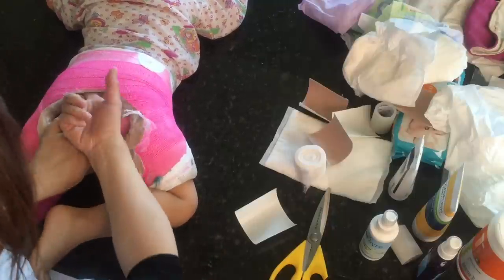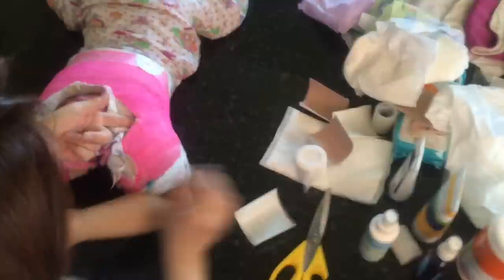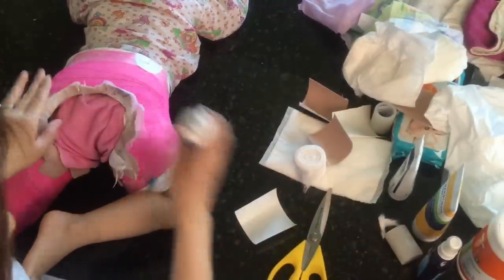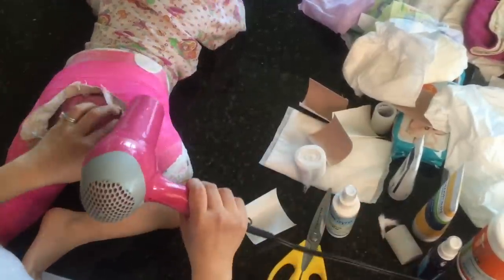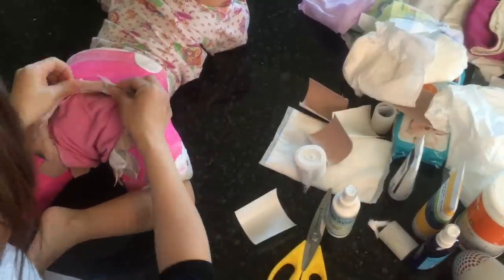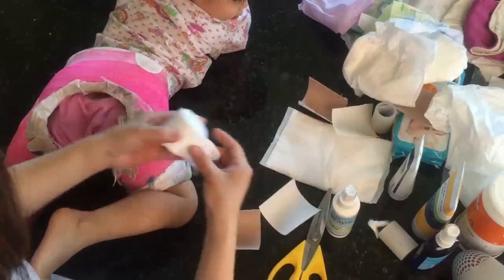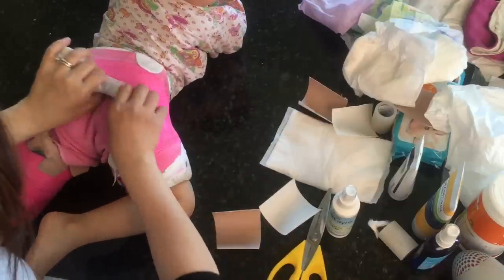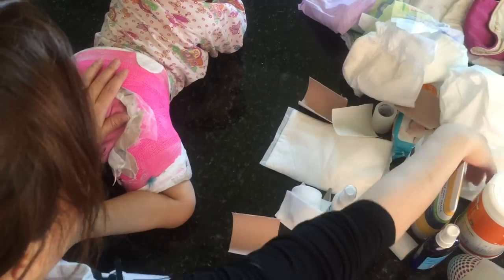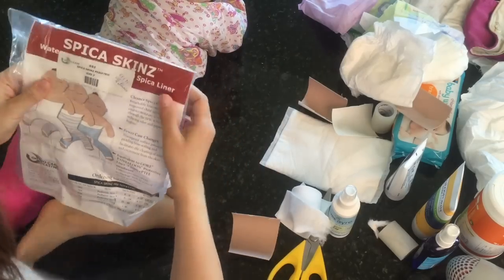This is my third time cleaning it. You want to go in and make sure nothing is wet. If you find anything wet, spray the odor eliminating spray — make sure you don't get it on her skin — and then blow dry it as dry as possible. Then add cushioning material. Sometimes the hospital will give you supplies; just make sure there's always cushion in there.